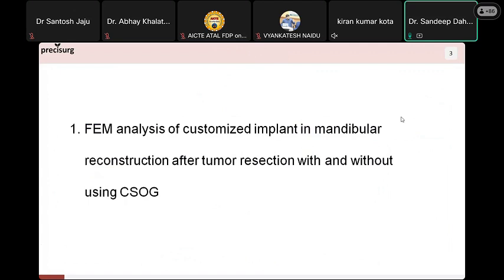So he took the radiograph, performed 2D sketching, then converted the 2D sketch into 3D images, then into an STL file, and then using 3D printing, he developed custom implants. In this particular case, he did not use any CT scan. He used a raw X-ray, the old radiographic technique.